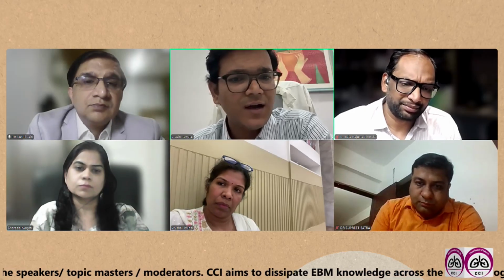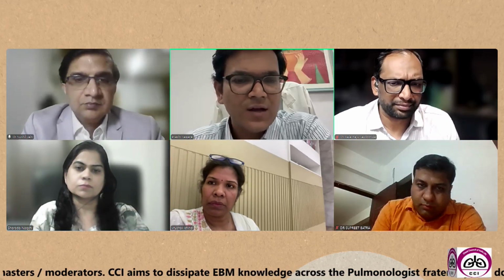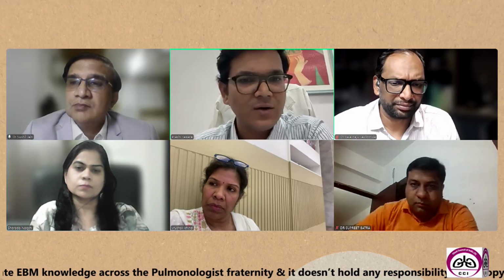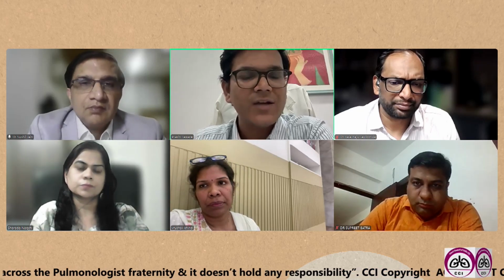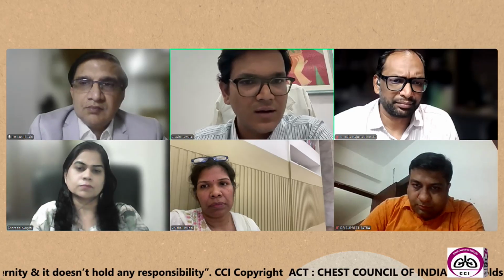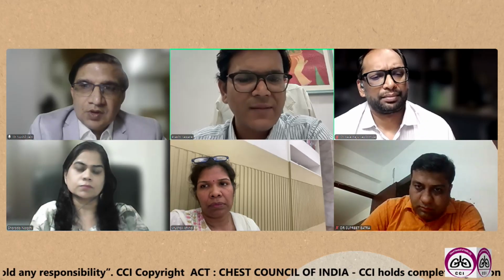So here passes and cores are different. If you are having 3 to 4 passes per node, and if you are targeting 2 nodes, you get 8 passes, like 8 cores, and then you can divide as per your pre-test probability. You can triage as per your suspected diagnosis. If it is malignancy, I would put 3 to 4 cores in formalin, and I'll make sure I give enough sample for the cytopathologist and for molecular diagnosis.